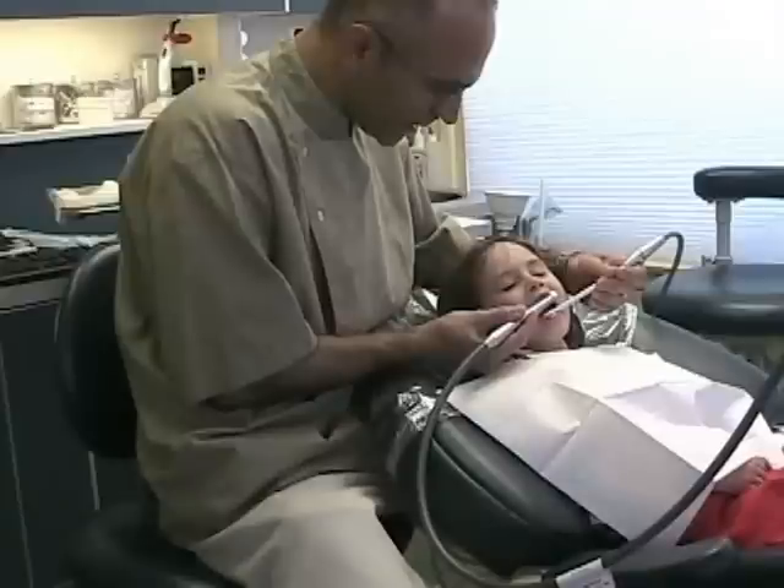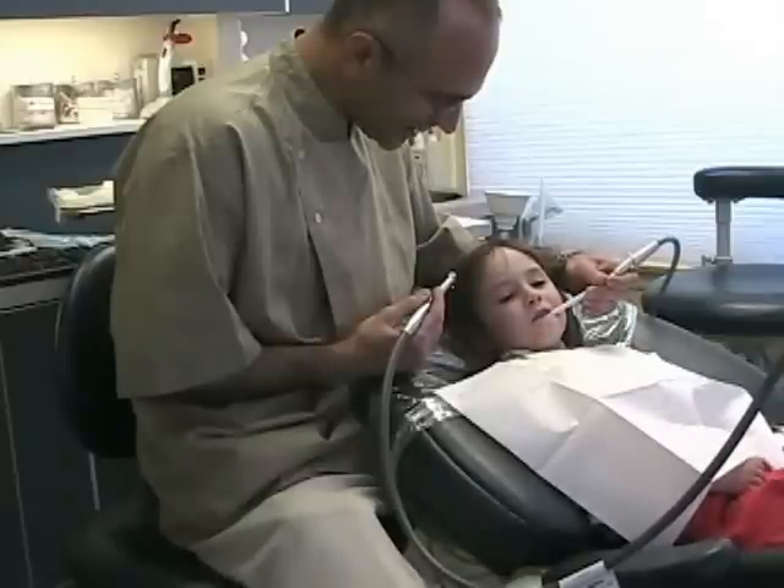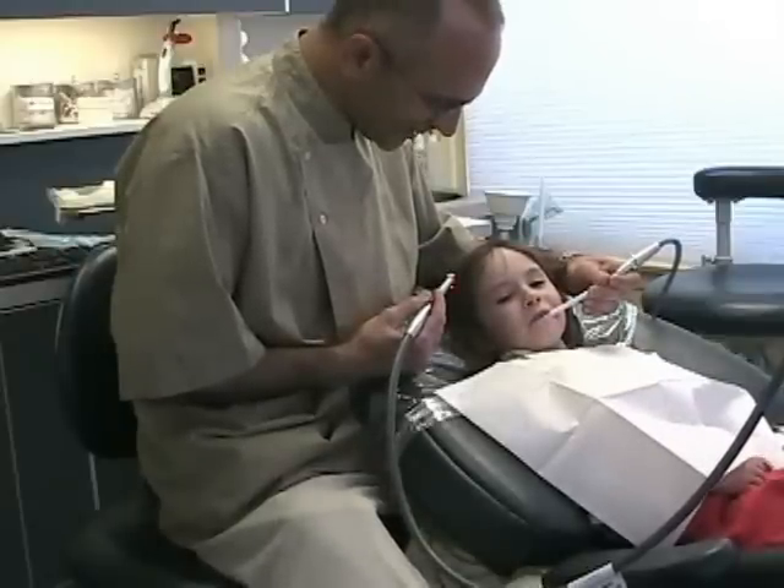And now we're going to count to five. One, two, three, four, five. Close your lips, close your lips. Good job.